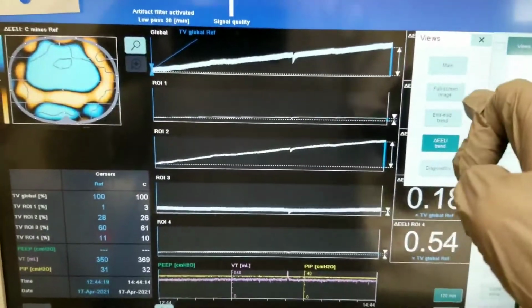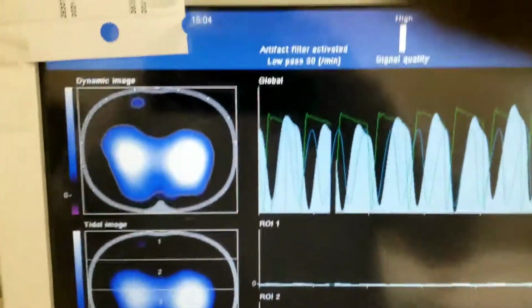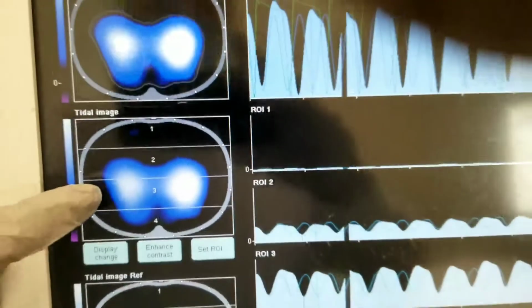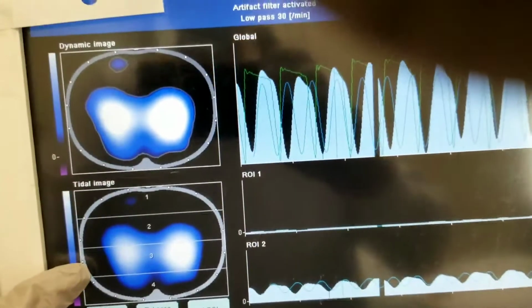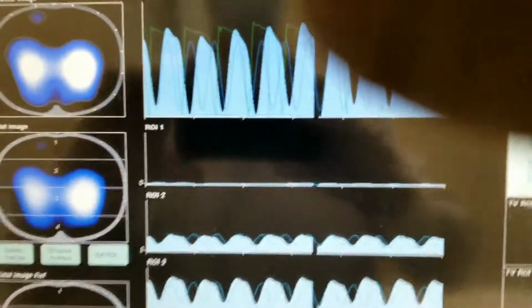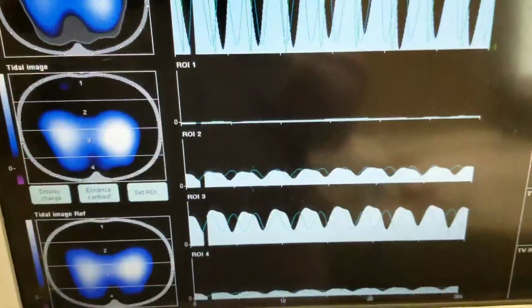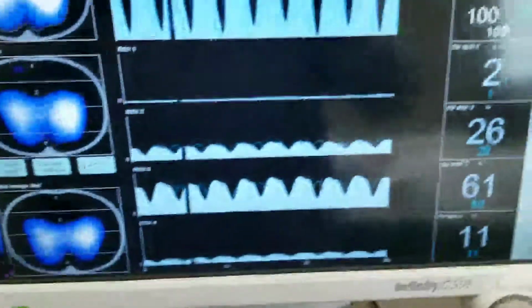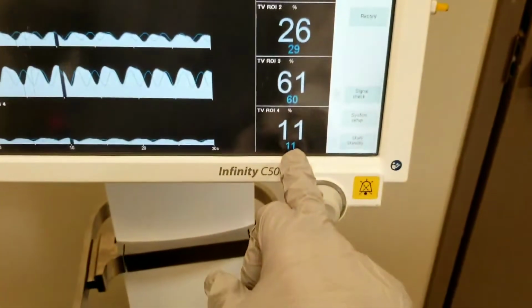And let's just do the main screen. This is what I was telling you. Notice here, 4 and 3, okay, are good. And let me just pause it because I'm shaking. Okay, sorry about that. Okay, so if you look over here, I referenced this.